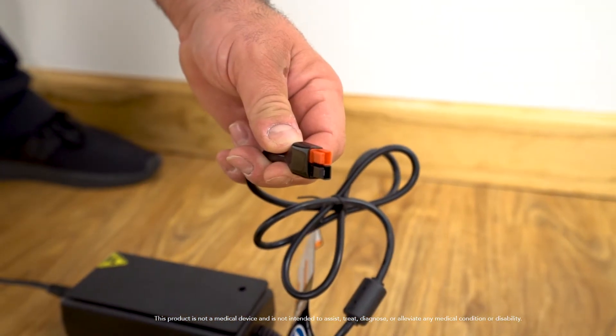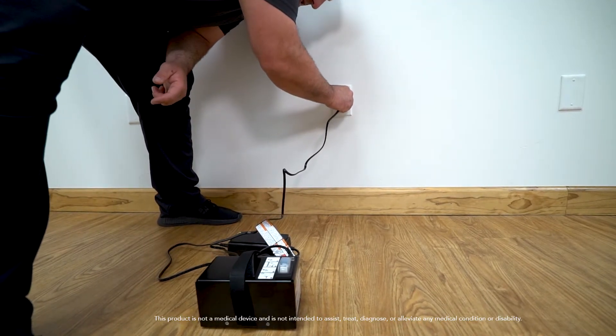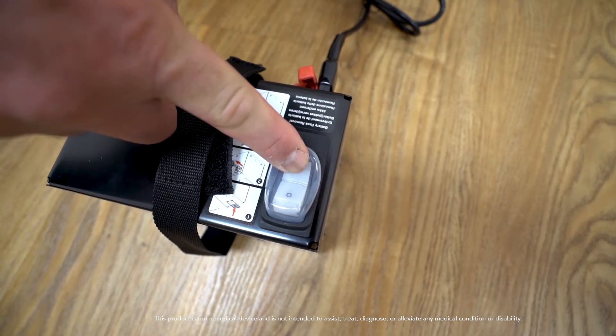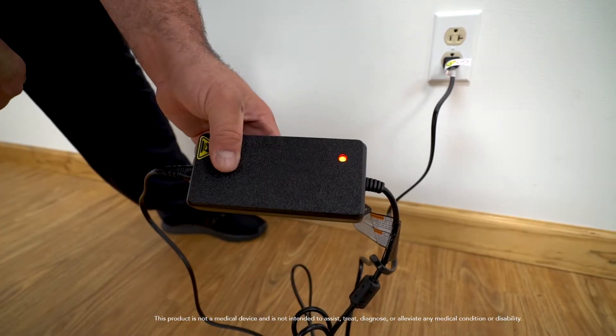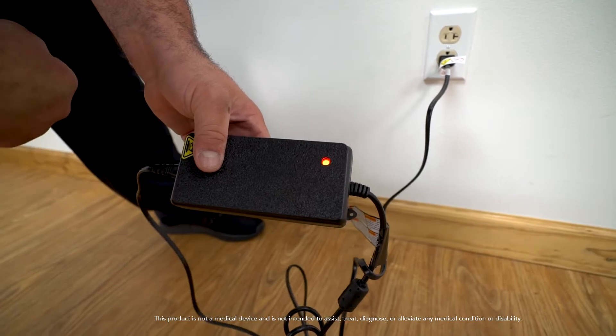To charge the lithium-ion battery, plug the charger into the battery and then plug into the wall outlet. You must turn the battery to the on position for the battery to charge. Note: do not use any type of extension cord to charge the battery.